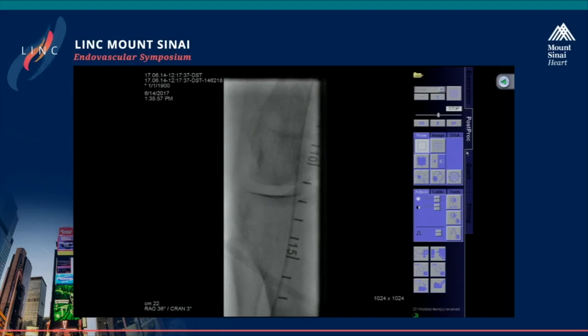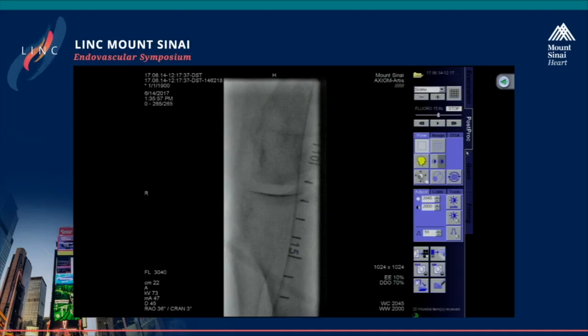So PK, what's your next step? Are you considering to perform atherectomy here? It's a pretty big vessel. Yeah, so now that we've crossed this, with multiple dissection planes, the question is, would you guys want to do a, yep, I got the wire. I'll clamp the wire on this side. Yeah, put a clamp on that. Should we do a laser here? That was our plan, to do a 0.9 laser, followed by a balloon.